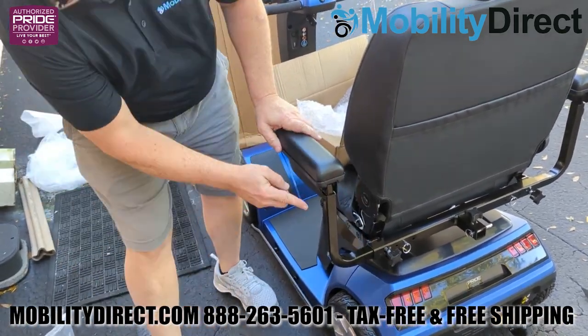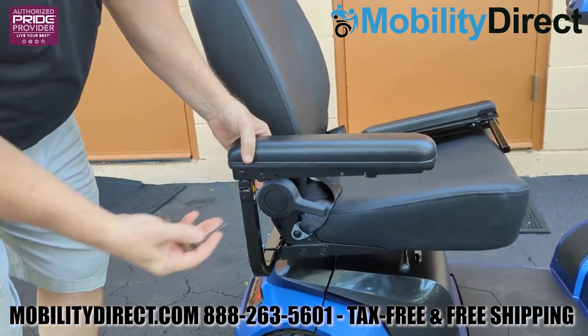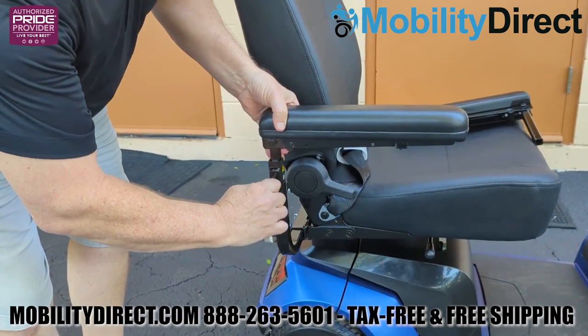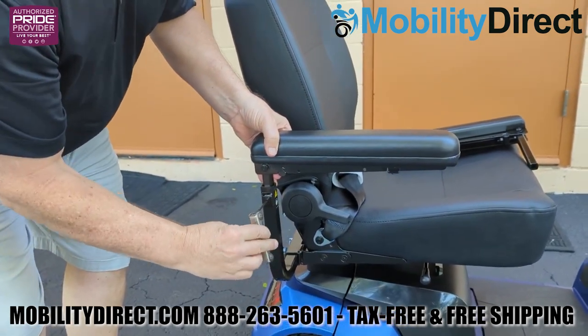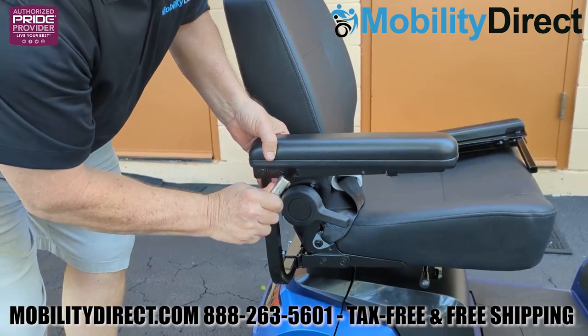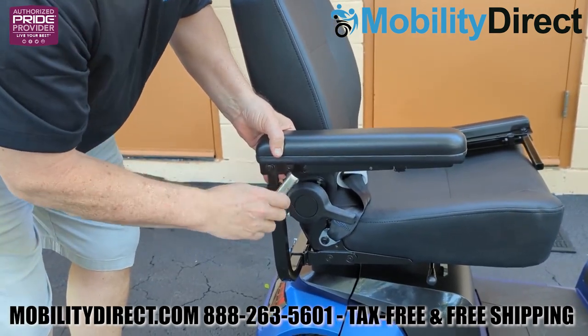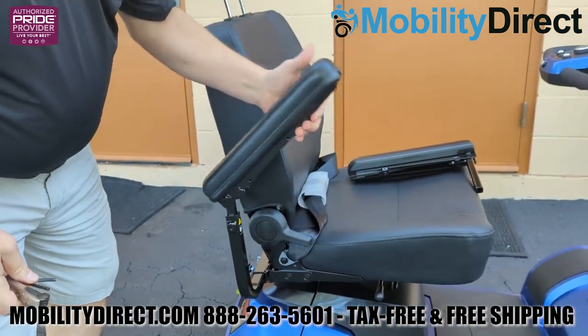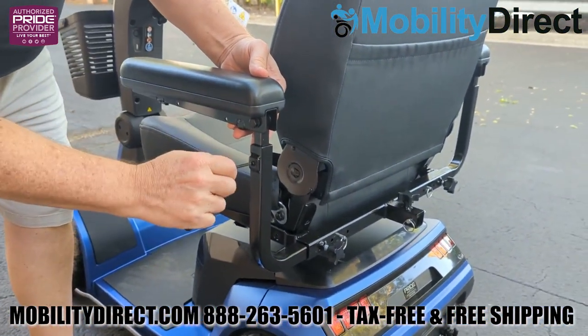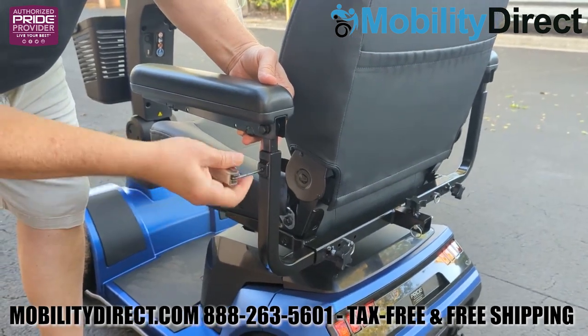You do need to raise the armrest about an inch before you tighten it with the provided Allen key that's in the user manual bag. If you don't, the armrest will not flip up. So make sure that when you're tightening the armrest adjustment set screw located on the side of the armrest with your Allen key, as shown here, that you have the armrest at least an inch up high so that it can flip up — otherwise they will not flip up.